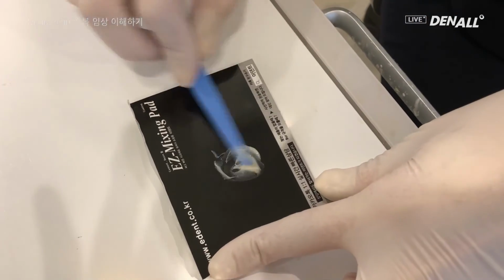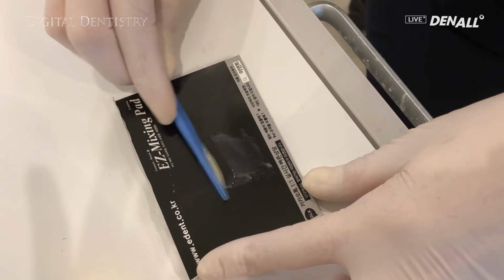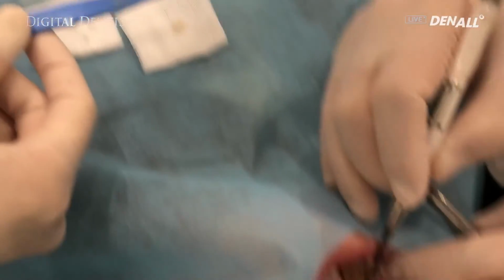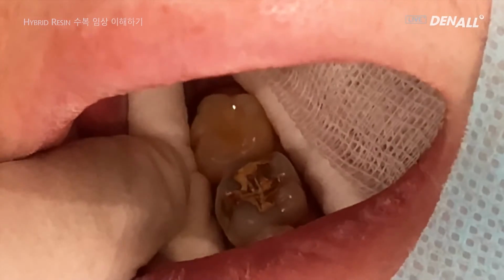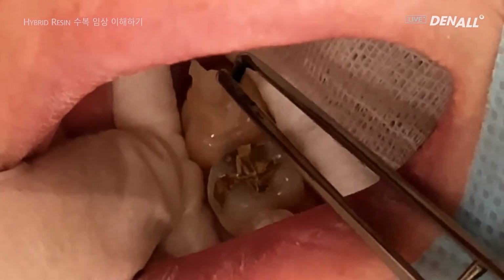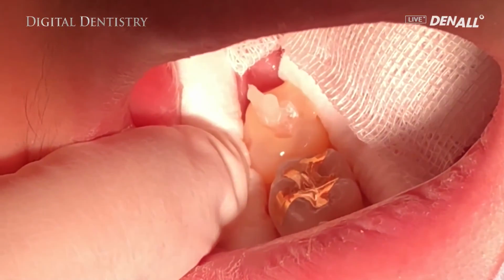After that, resin cement is mixed as shown. You mix thoroughly using a resin applicator. You put the cement within the oral cavity. You apply it evenly. Before it is set, within a short period of time, you fit it in. And after that, you press the middle and check whether it is perfectly set.